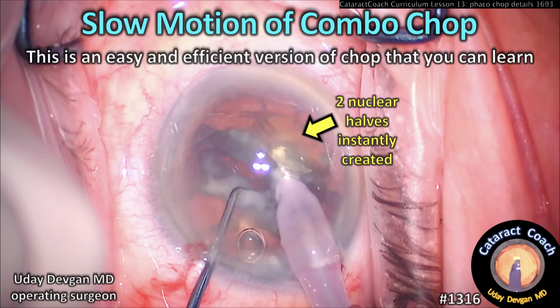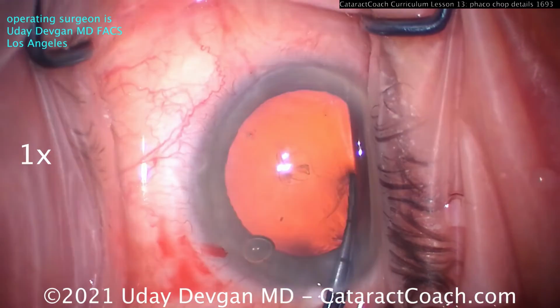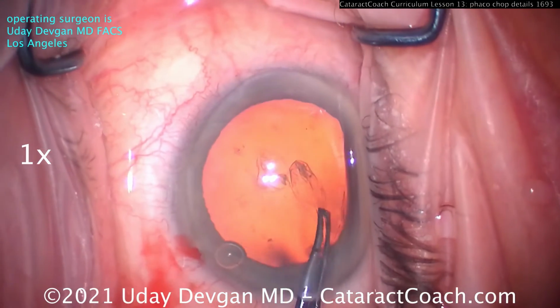CataractCoach.com. Slow motion of combo chop. This is an easier and more efficient version of chop that you can learn. Let me teach you. So let's start off with showing you the rhexis. Now you see the left side of the screen, the 1x, this is in real time.